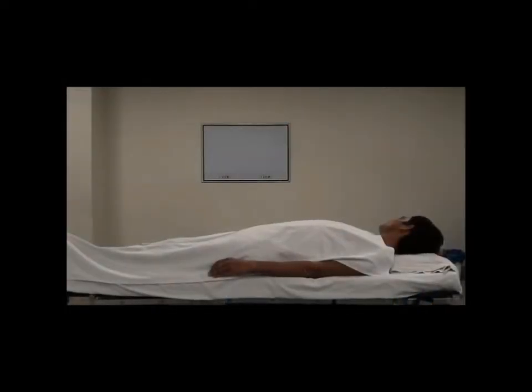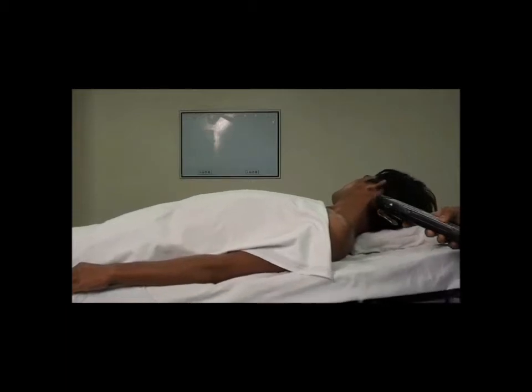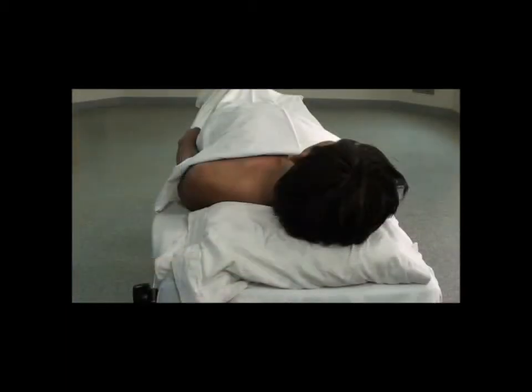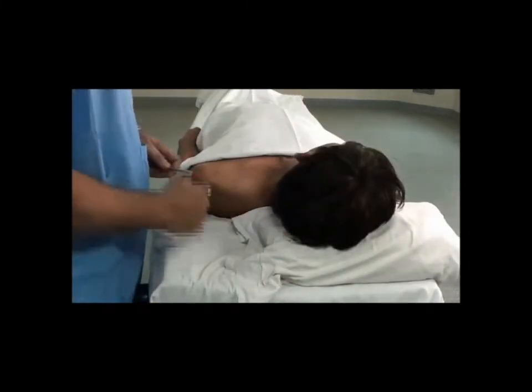For an effective block: first, make the patient lie in supine position; second, ask him to look to the opposite side; third, make the patient propped up 35 to 45 degrees; fourthly, push the pillow to the opposite side so that you get space to site the injection.